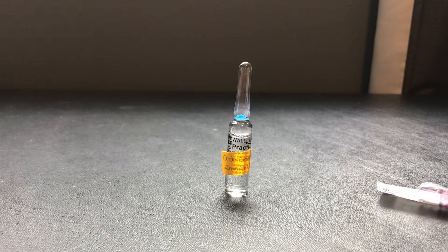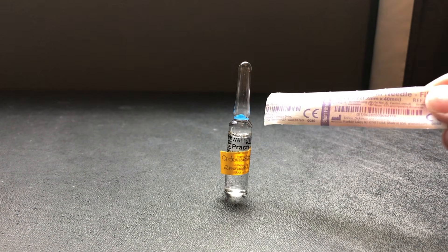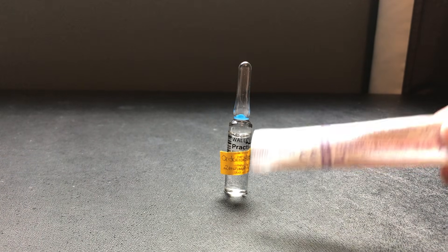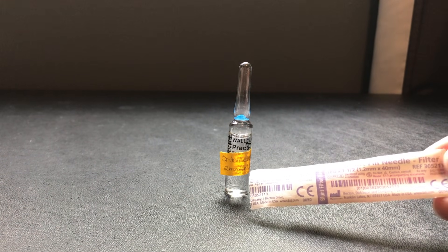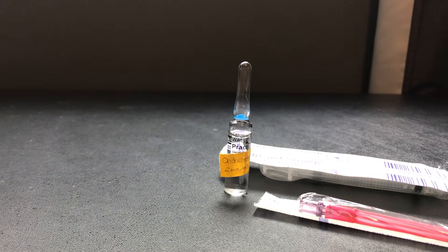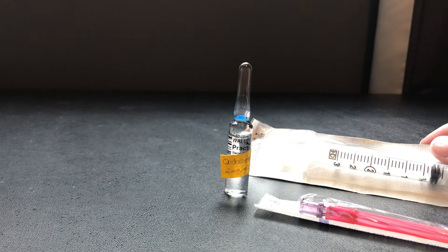Gathering my supplies: because this is an ampoule, when I break it off there are likely to be shards of glass we can't see, so I need a blunt fill needle. I'm going to use a 3 mil syringe because I'm drawing up 2 mils — my order is for 4 milligrams.